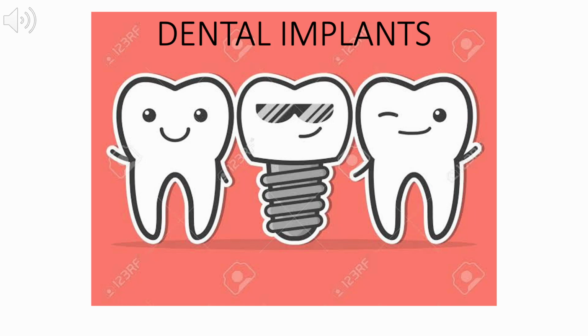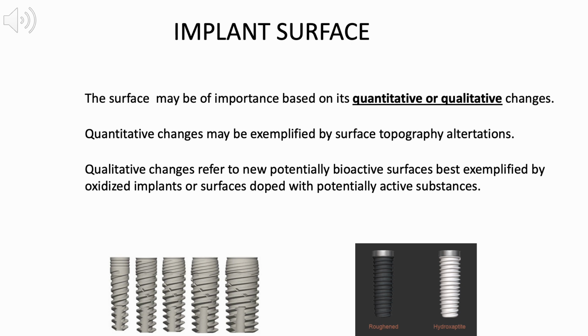Dental implants. Implant surface. The surface may be of importance based on its quantitative or qualitative changes. Quantitative changes may be exemplified by surface topography alterations. Qualitative changes refer to new potentially bioactive surfaces best exemplified by oxidized implants or surfaces doped with potentially active substances.